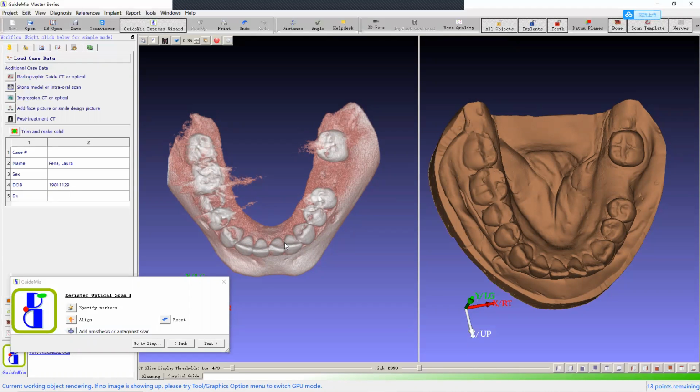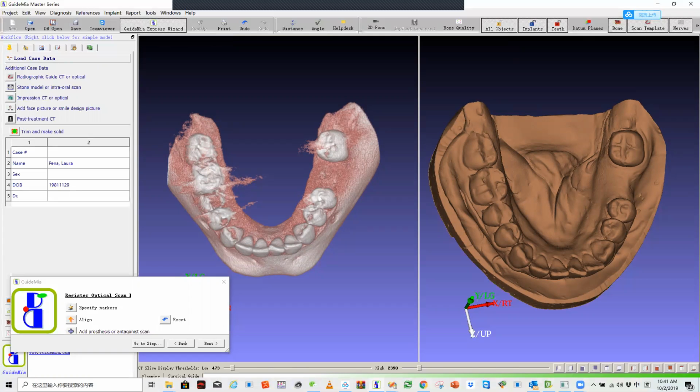I got you. I have a patient right now. Every tooth in her head has a crown on it, and we need to do some implants. She has no missing teeth. Every tooth has a crown. I need to do an implant on numbers 8 and 9, but the teeth are still in there. So what do we do? We make a radiographic guide. But I can't make it. They have no teeth missing.